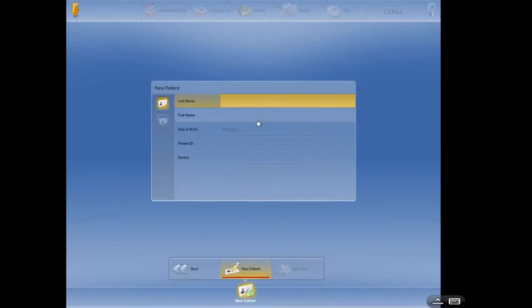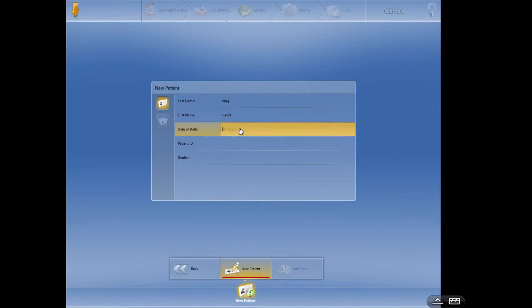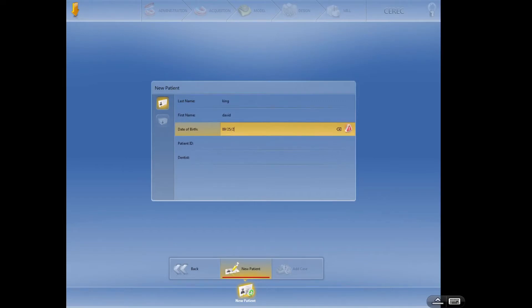So last name, I'm just going to put in myself. First name David. Date of birth, let's just put in today's date just for fun. 25, 2, 0, 1, 7.